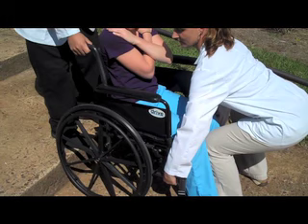Proper body mechanics should be used when lifting a wheelchair. These include a wide base of support and low center of mass while staying close to the wheelchair.